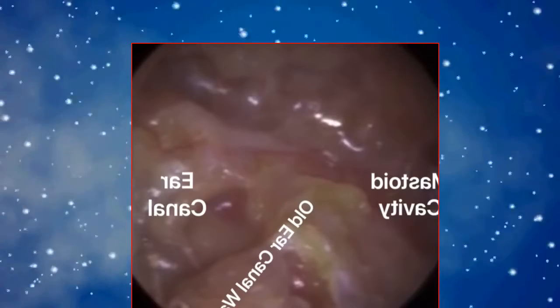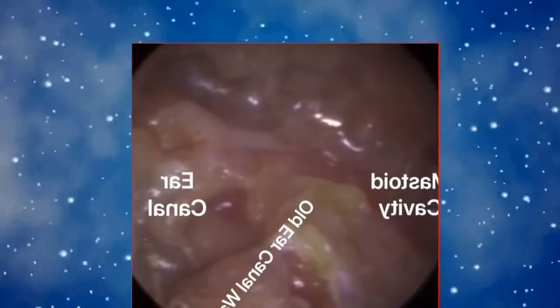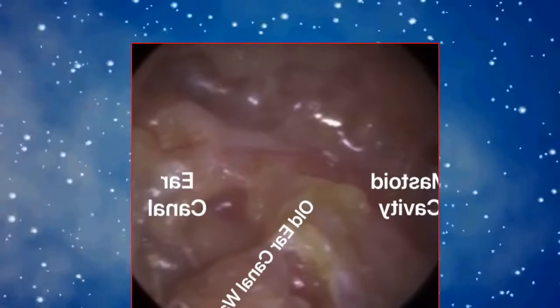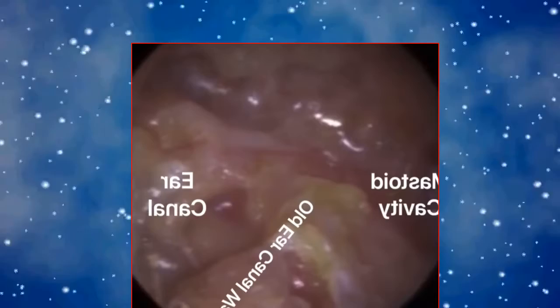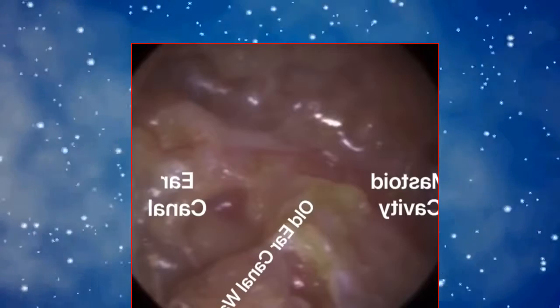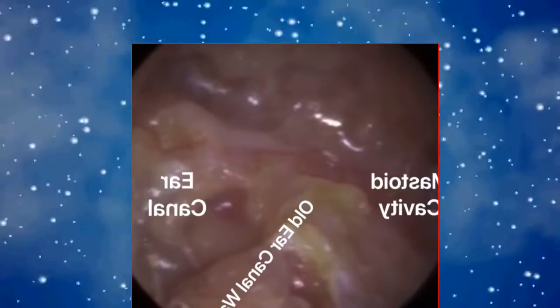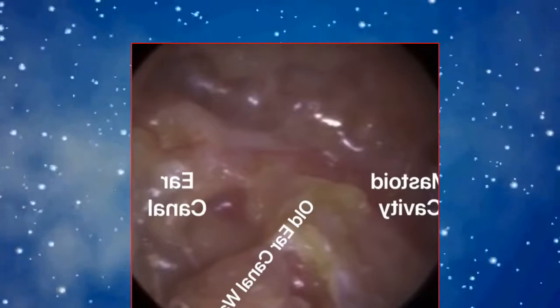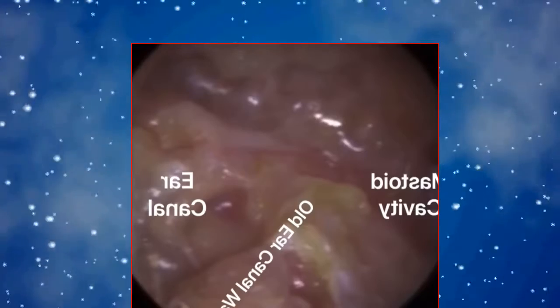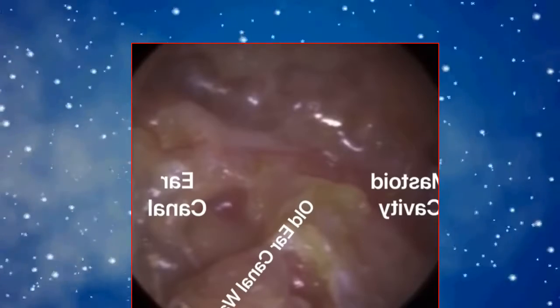So the benefit of that is that the ENT surgeon can be really sure that there's no dead skin left behind, because you've opened up the canal completely and you can see everything. So there's a really minimal chance of a recurrence of a cholesteatoma or mastoiditis. However, when you've got a big open mastoid cavity, skin doesn't migrate as well. So that skin, as you can see, is layering, coating the canal wall. So an open mastoidectomy needs regular cleaning. This skin does need to be cleaned as it's not shedding naturally, because that skin can get infected. And obviously, patients are going to be really careful of avoiding water in the ear.